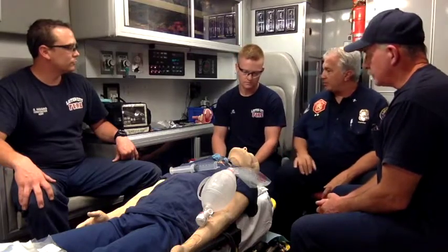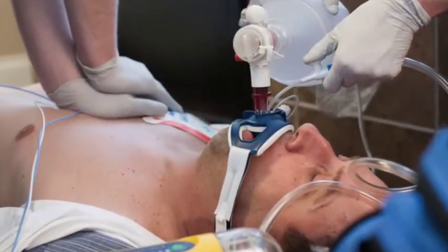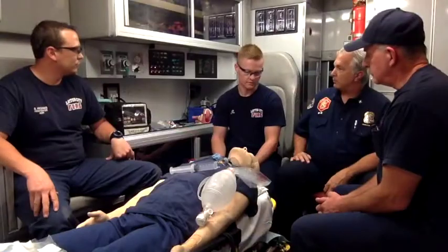So when are we going to use these things? On our cardiac arrests or our unconscious, no gag reflex patients.